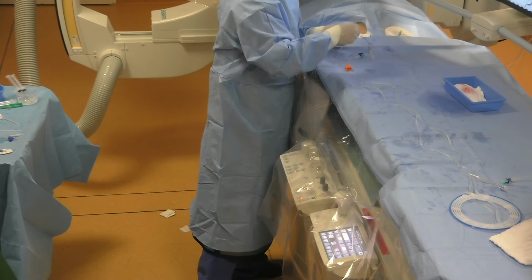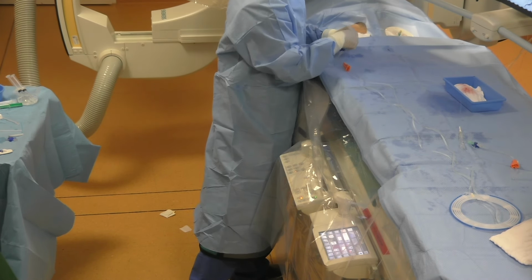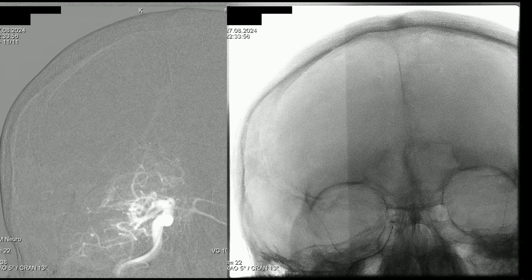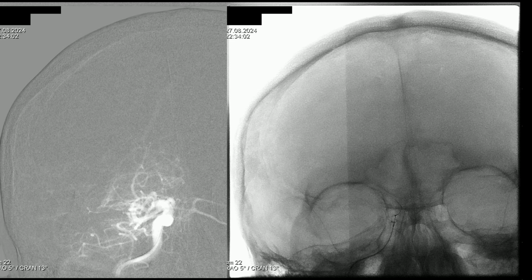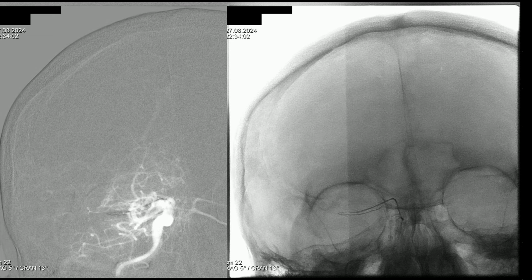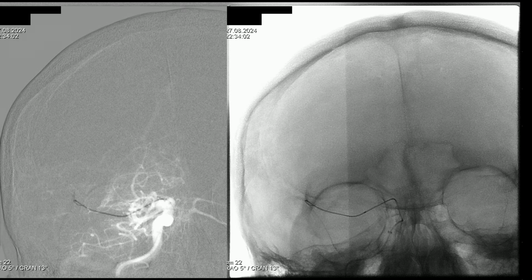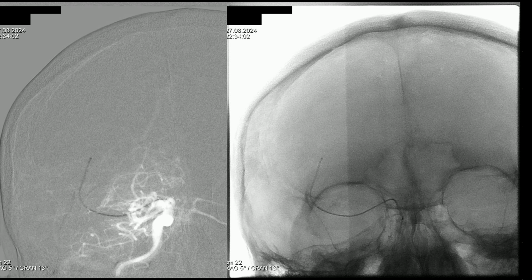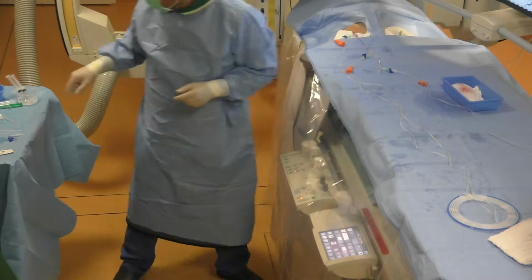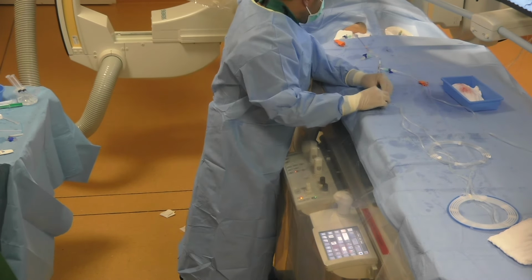and take the microcatheter Rapid Transit 25 by 150 centimeters and push it with the microwire inside the aspiration catheter. We go inverted in the right MCA, and now we should be careful when we pull the microwire back in the catheter. Now we can push the microcatheter in the distal segments of the MCA without the microwire so that we don't go in small vessels.